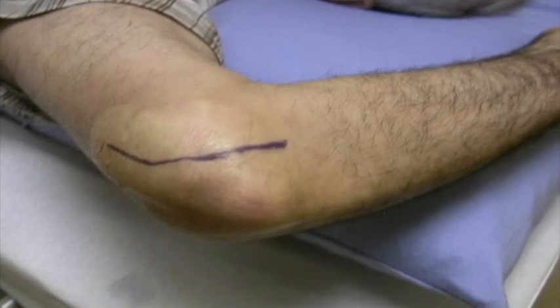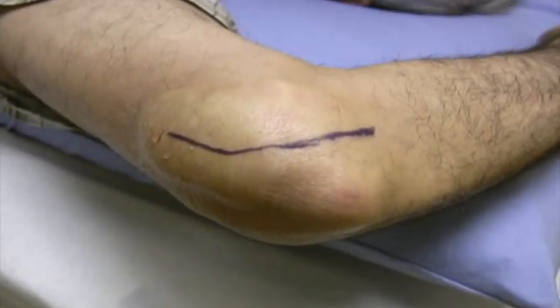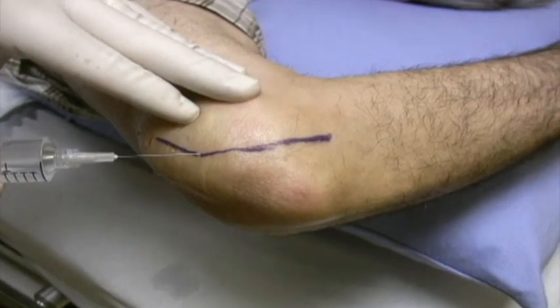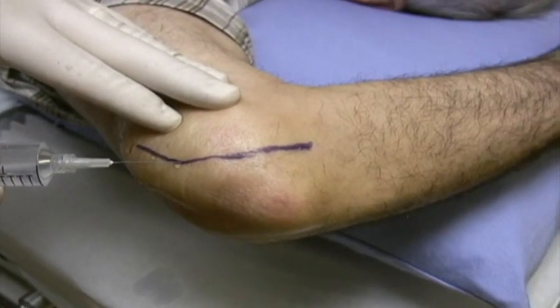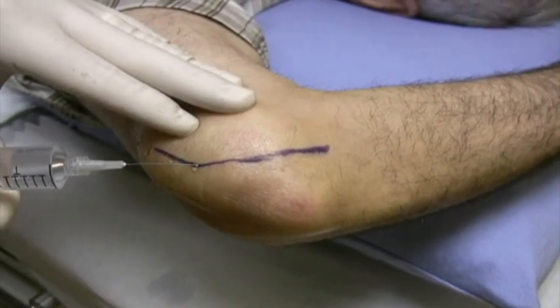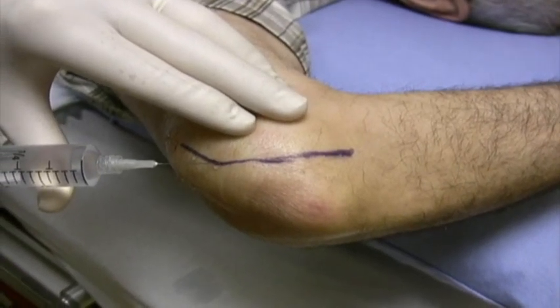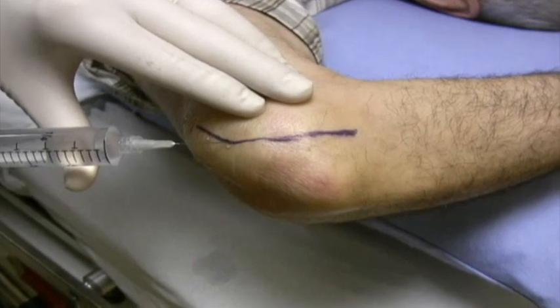So that's 20 cc's in the elbow so far, so we're going to put in the second 20. This is also 0.5% with 1 in 200,000 epinephrine. Did you feel that little needle? No. So far, just the first poke, right? Yeah. And we hope that that's how we continue.